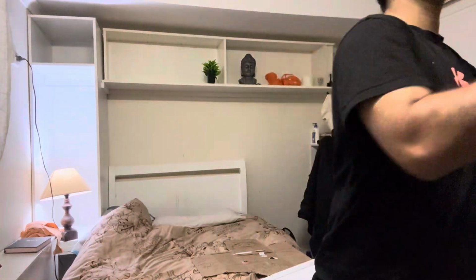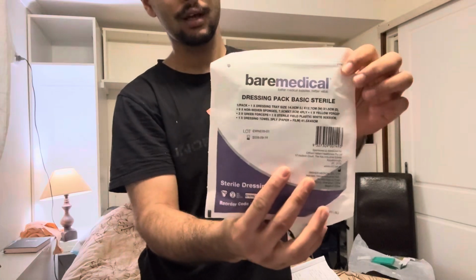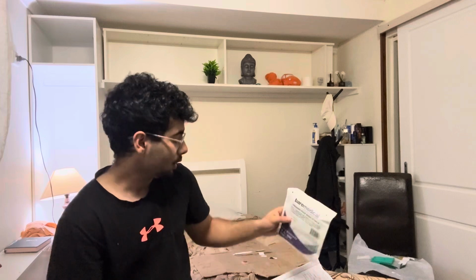For example, my chair is my trolley for now, and I have already opened the wound pack, but I'm going to show you a wound pack as well, how it looks. So the wound pack looks like this. This is the wound pack. It has a date on it as well. You have to check the date before taking it out. Inside there are some forceps, some cotton balls, and you can put saline on. You have different salines.